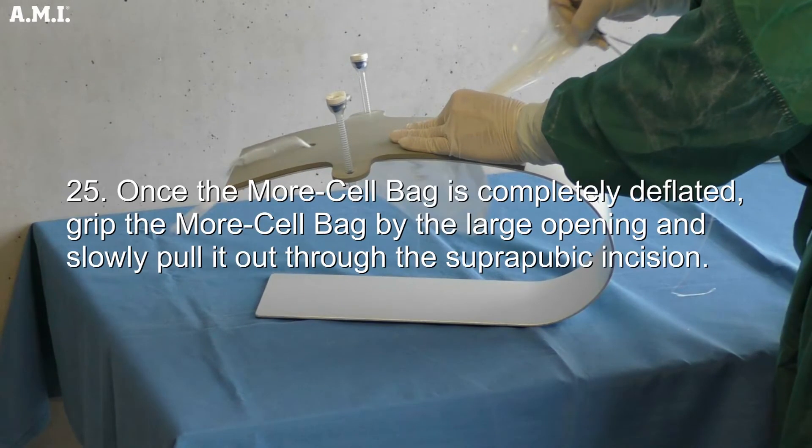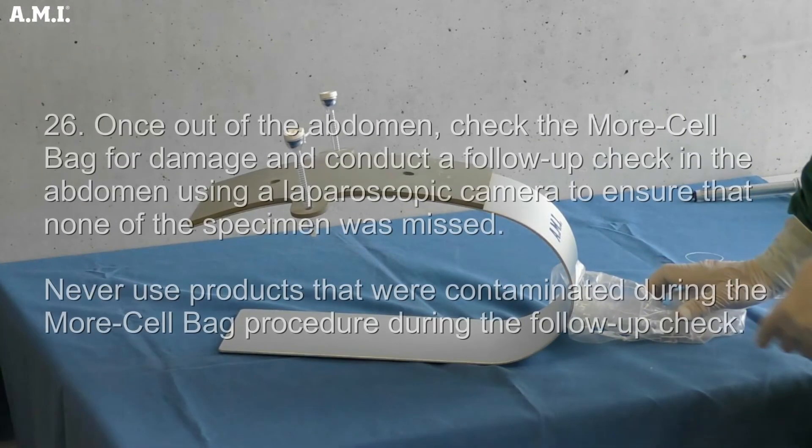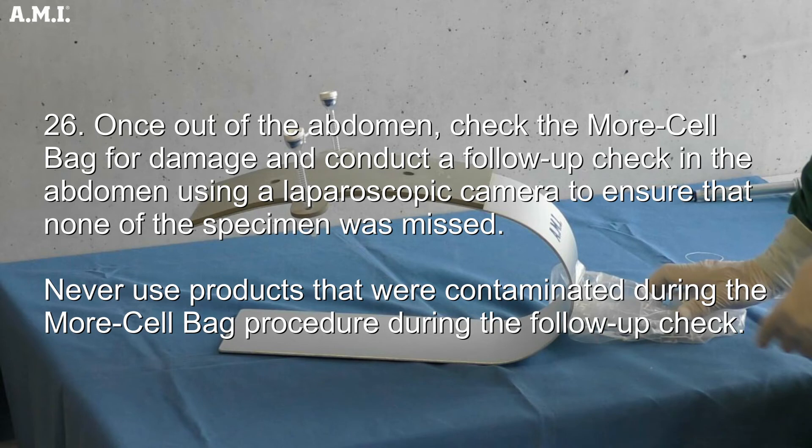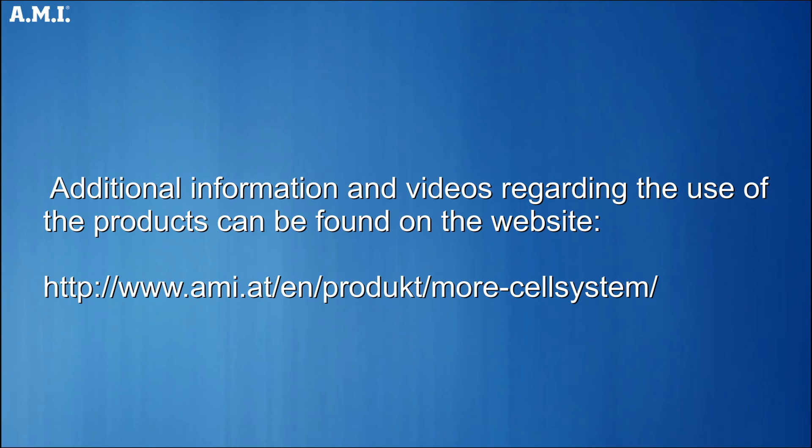Once the More-Cell Bag is completely deflated, grip it by the large opening and slowly pull it out through the suprapubic incision. Once out of the abdomen, check the More-Cell Bag for damage. Conduct a follow-up check in the abdomen using a laparoscopic camera to ensure that none of the specimen was missed. Never use products that were contaminated during the More-Cell Bag procedure during the follow-up check. Additional information and videos regarding the use of the products can be found at www.ami.at under the More-Cell System product page.